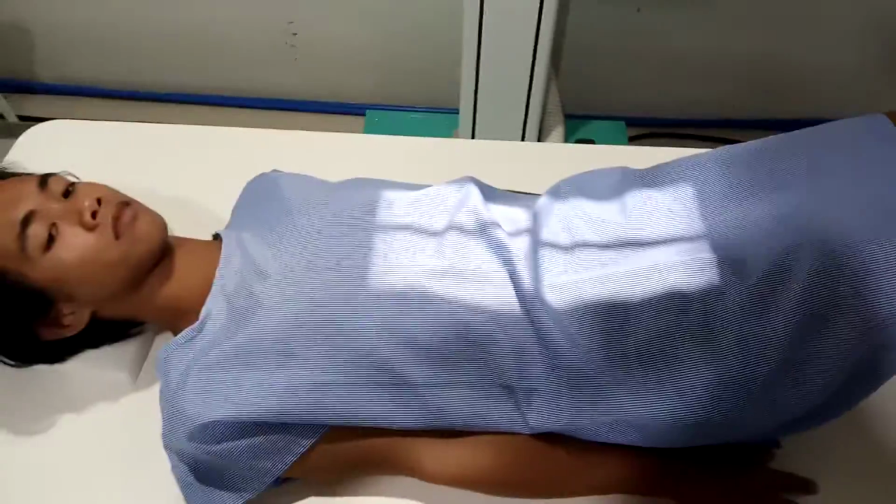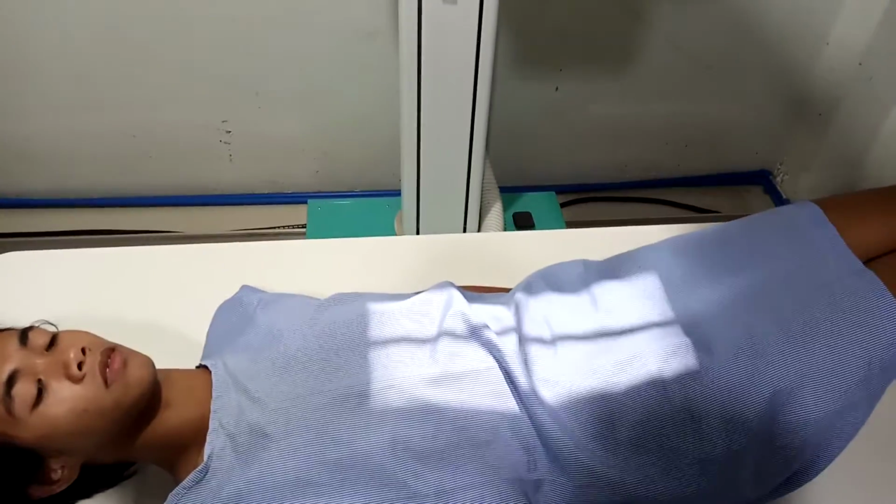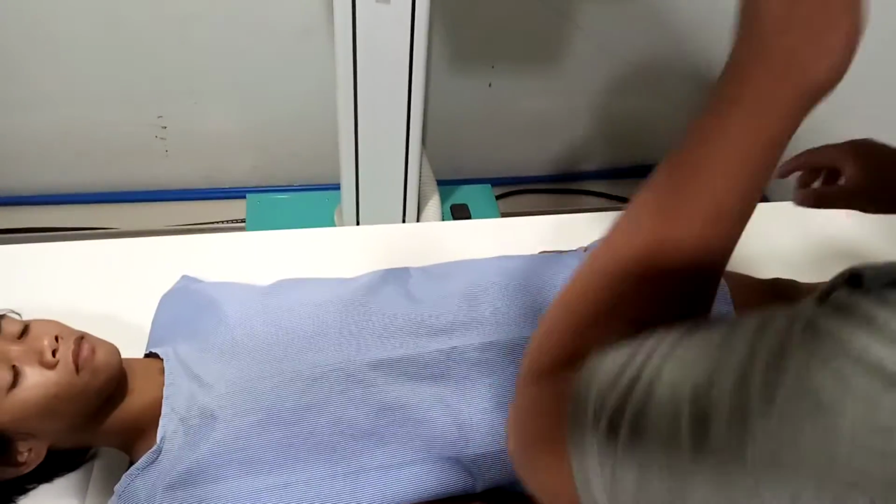The next position and the last position will be the lateral position of lumbosacral vertebrae. So, in patient positioning, position the patient lateral with the hips flexed.